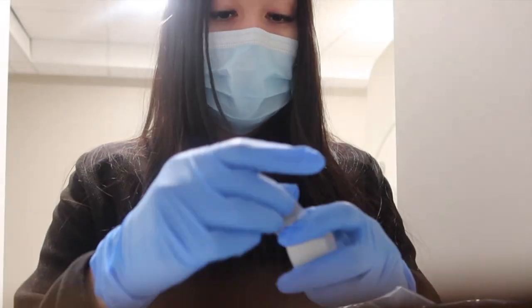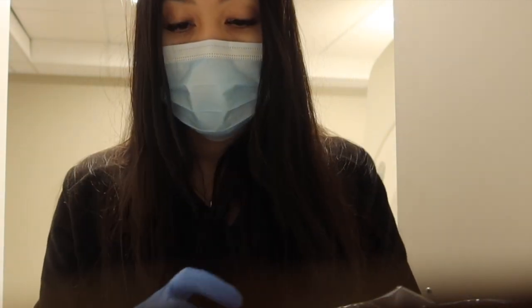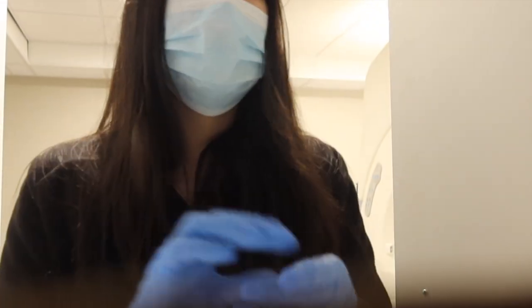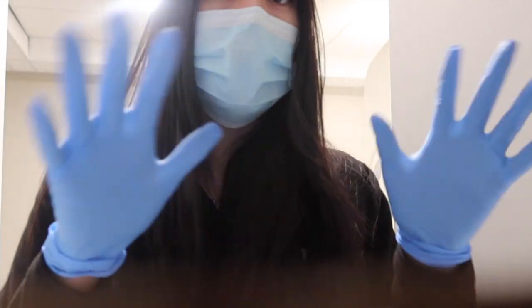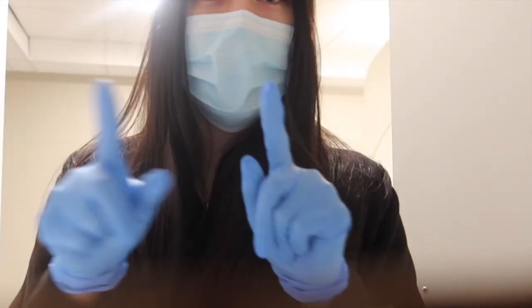All this goes in here, and tape — I don't know why this tape is supposed to be in there. That's pretty much it. Once I have this set up, I just like to leave it in here because I don't really need it right now. I'm going to change my gloves and then I'll grab you guys in just a second.